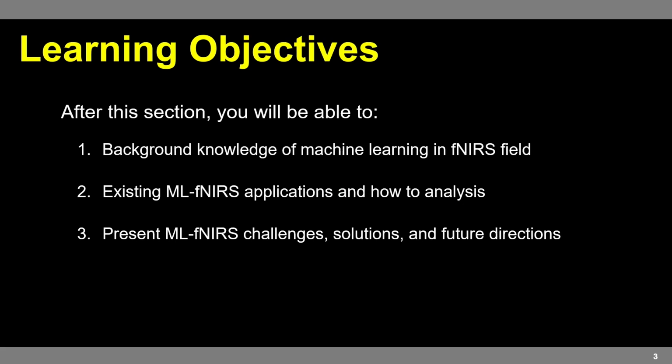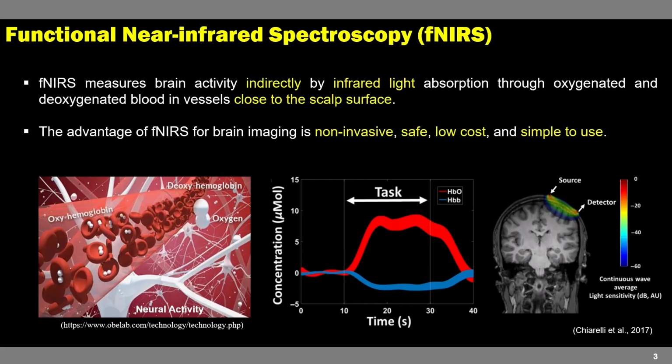After this session, you will know the background knowledge of machine learning in the fNIRS field, the existing machine learning fNIRS applications and how to analyze them. And in the last part, you will know the challenges, solutions and future directions.